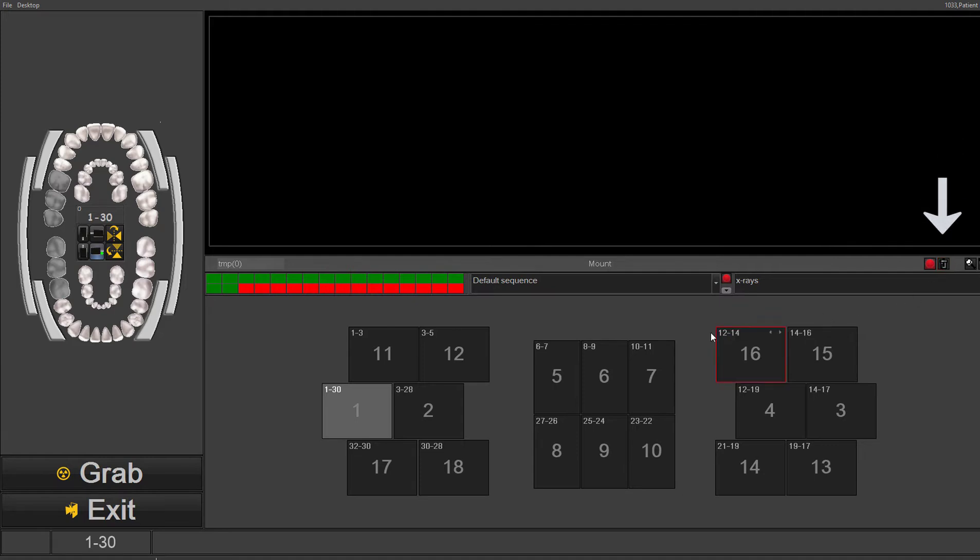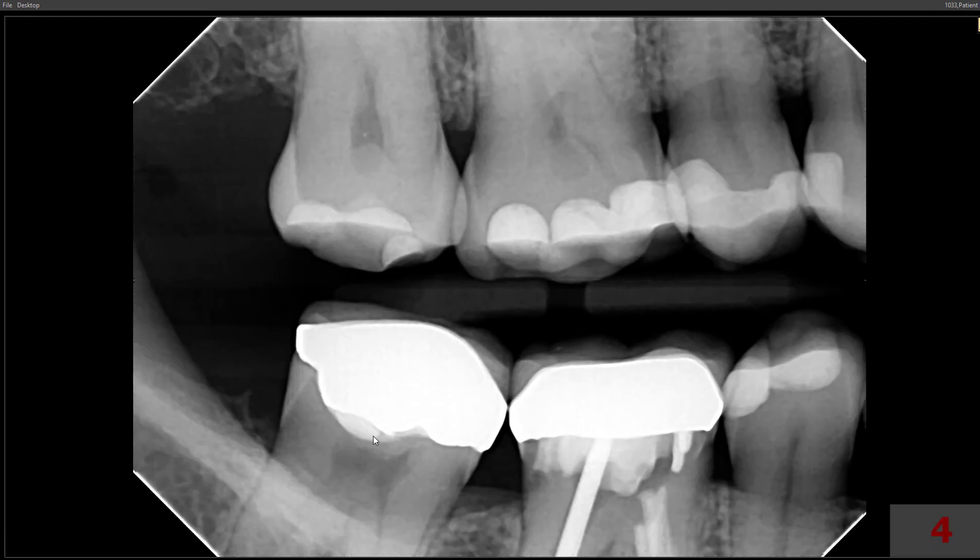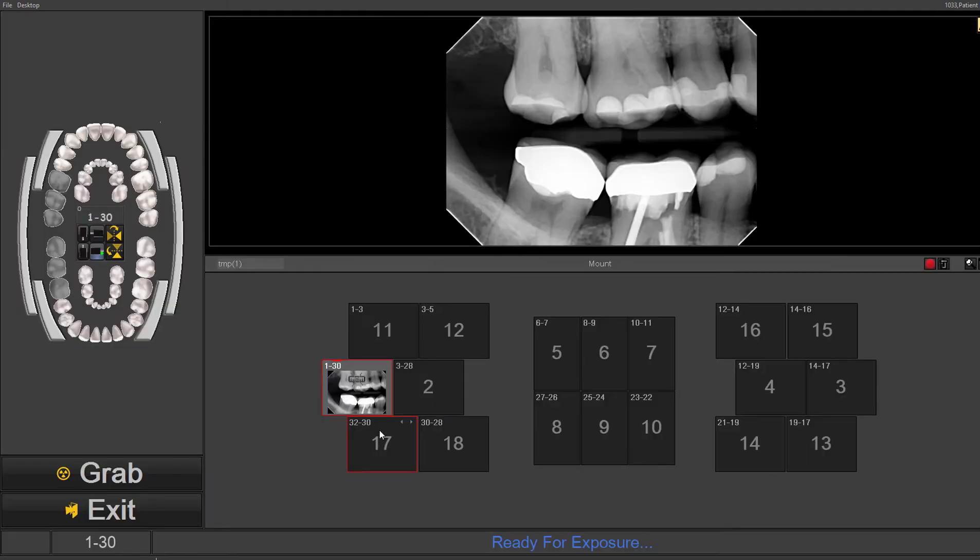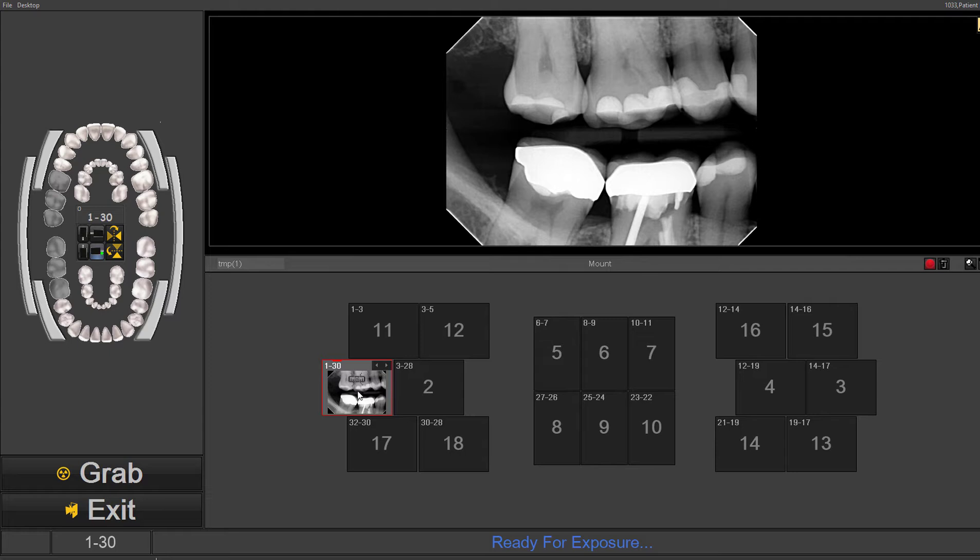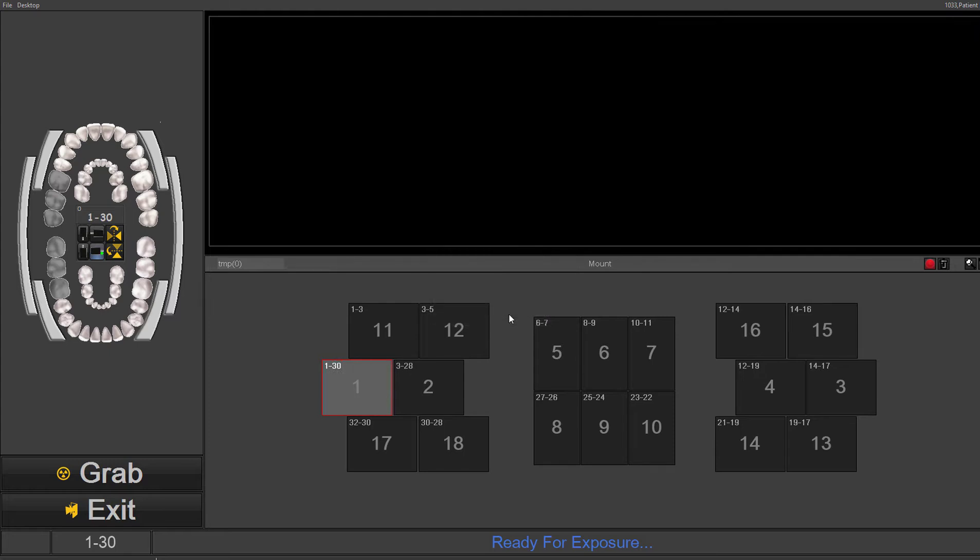So if there are images that you don't like, even within the acquisition, you can retake and just take the image, click on the image to highlight it. You can left mouse click and drag and drop into the trash can. It will always ask you to confirm if you want to delete the image. And then once you've deleted it, it is gone.